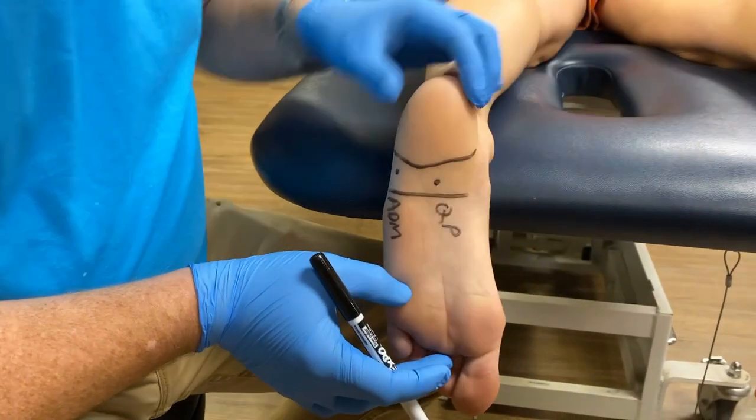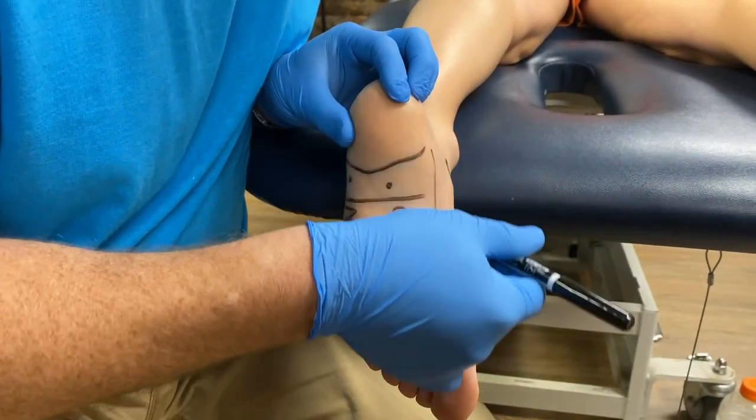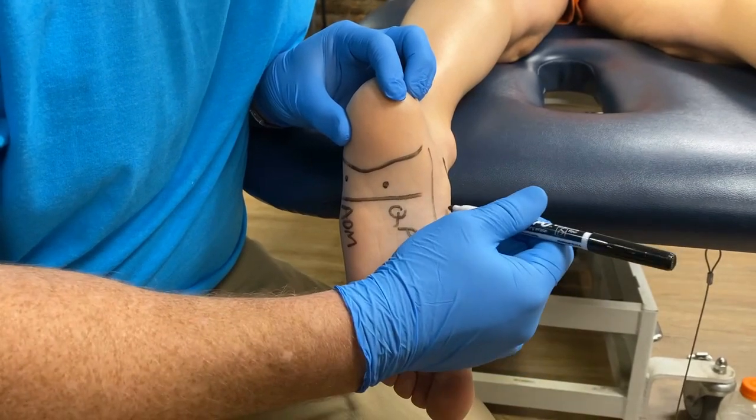Now we'll draw our abductor hallucis, which is basically on the inside of the arch of the foot. We have to be superficial here, however, because we have our medial plantar vein deep to that.